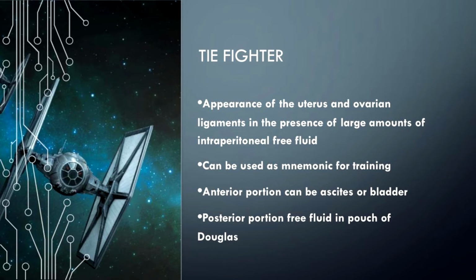All right, let's go on to the TIE fighter sign. So the TIE fighter sign is a fun one because it's associated with Star Wars, and Star Wars has a very large fan base. Given that fact, a lot of people know what a TIE fighter is, so it allows you to remember or recall this sign with the certain pathology.